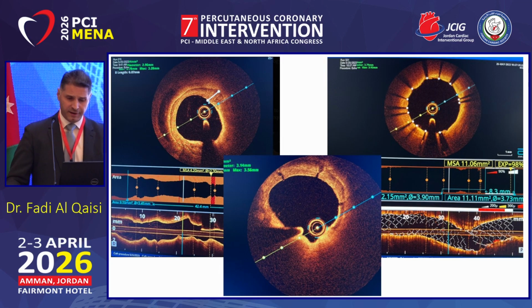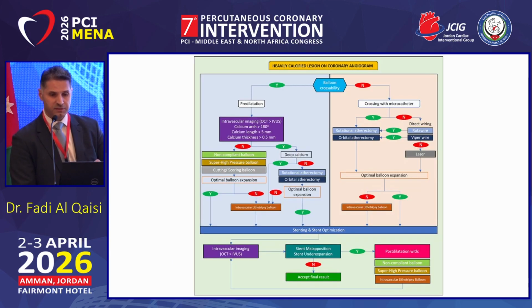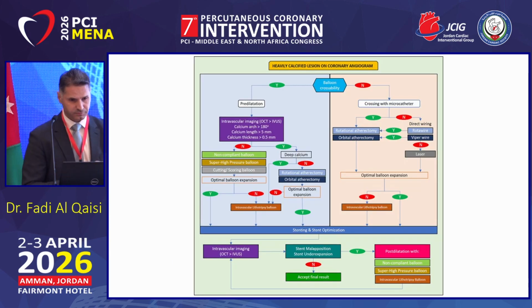This is another case of lithotripsy on OCT. Obviously I did this in the US. You can see here how deep the calcium is and you can see here the cracks. These are the cracks that we generated in the calcium by the lithotripsy. Then I was able to put the stent with full expansion. Those dots are the stent dots.